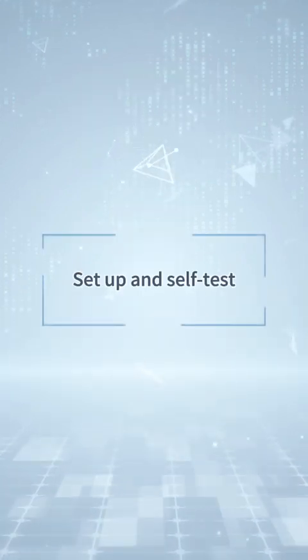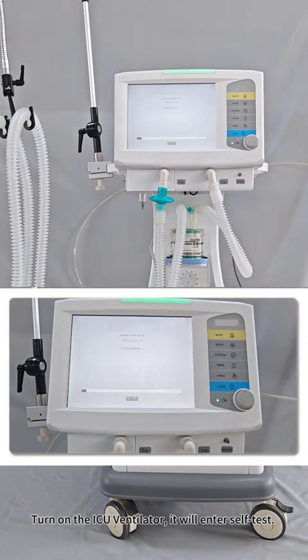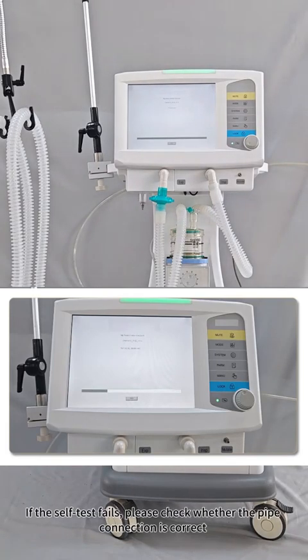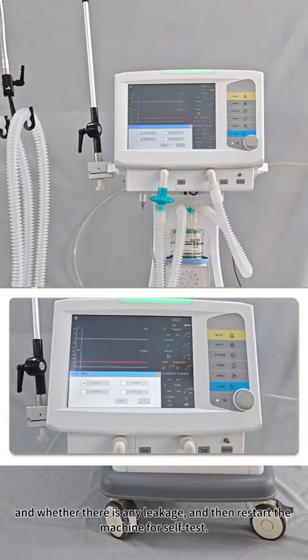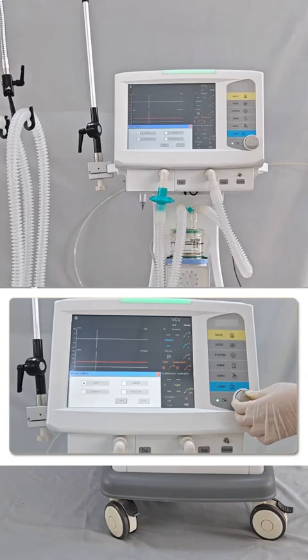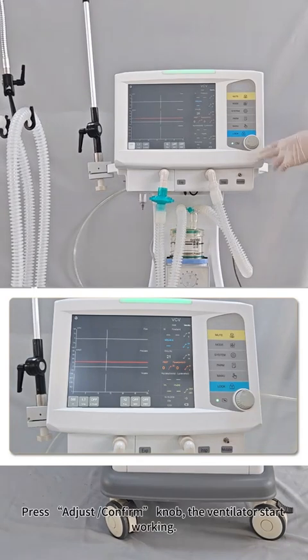Setup and self-test. Turn on the ICU ventilator, it will enter self-test. If the connection is correct, the ventilator can pass the self-test directly. If the self-test fails, please check whether the pipe connection is correct and whether there is any leakage, and then restart the machine for self-test. After the self-test is completed, select the patient and mode and enter the standby mode. Press the adjust/confirm knob, and the ventilator starts working.